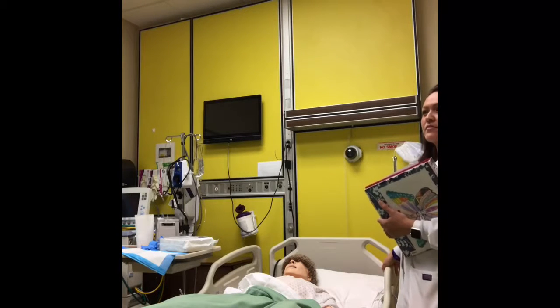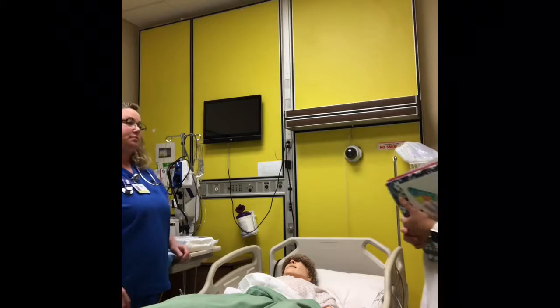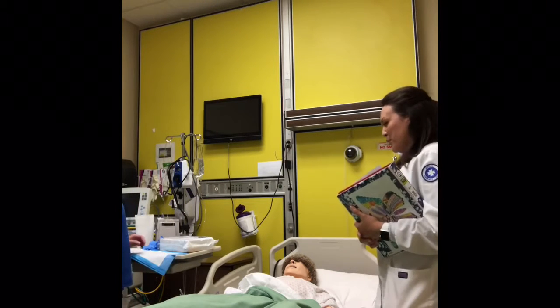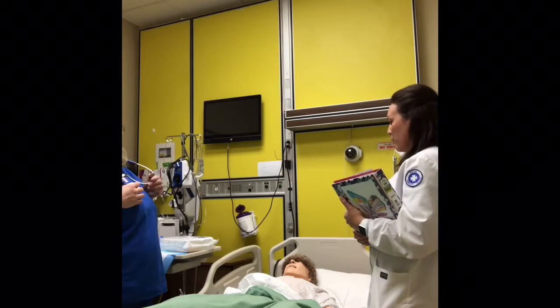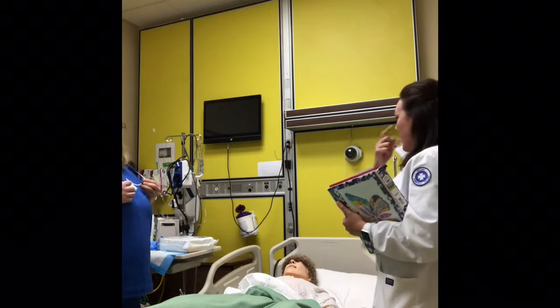So today we're going to go over teaching someone how to do a Foley. Nurse Janet here is going to teach my nursing student Amber how to properly insert a Foley catheter on a female. I've already asked Amber, the student nurse, to go over the procedure with the patient and to see if the patient had any questions.